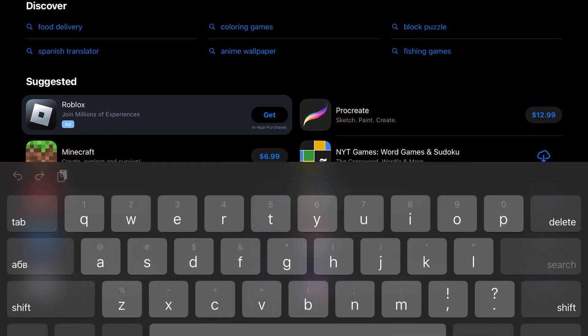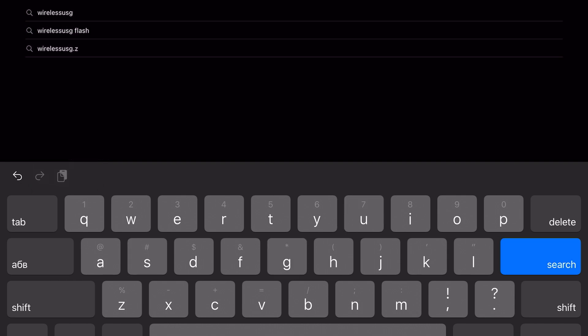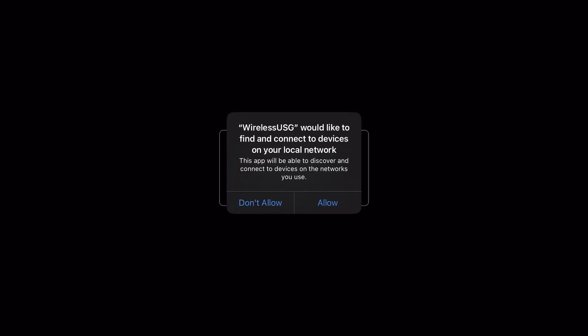First things first, download the app, which is called WirelessUSG. You download it, open it, and then click to allow it to share its location during use and then allow it to connect to your network. This is what the app looks like.